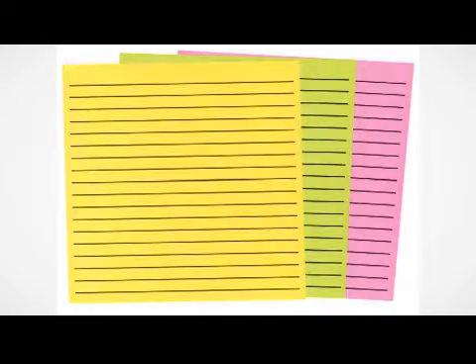Bold lined paper. Bold lined papers have lines that are darker, denser or wider than regular lined writing paper. Bold lined paper can be helpful for low vision persons. Lined paper is easier to write on than blank paper. The lines provide a reference point for writing letters. We should experiment to find the kind of lined paper that works best for the individual. The students may want to use bold lined paper and a marker at first, then move to regular lined paper and a pen as they become more comfortable with writing.